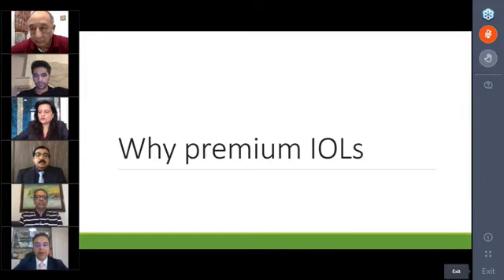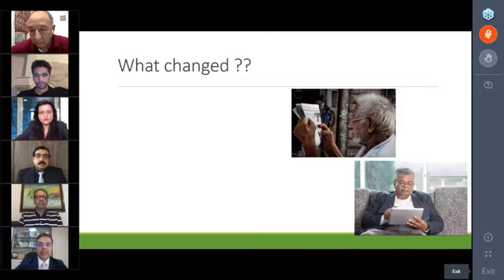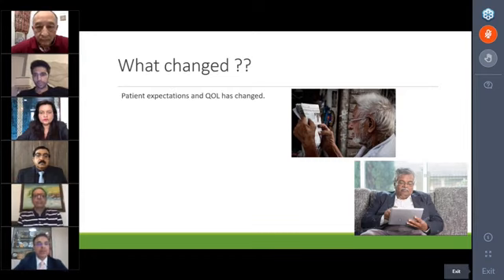Why should we be talking today about premium IOLs in the first place? What has changed over the last 50, 60 years that today we are talking about premium IOLs? And frankly, what are premium IOLs? I think what's really changed in the last 20 years is that patients' expectations and quality of life have changed.